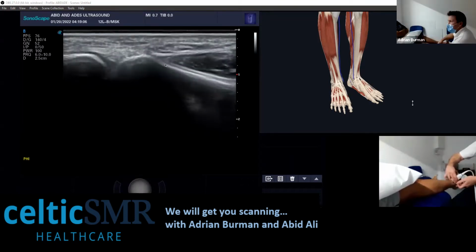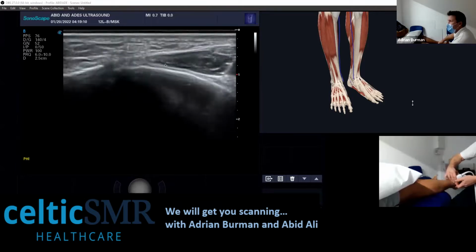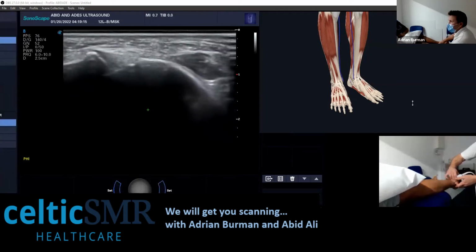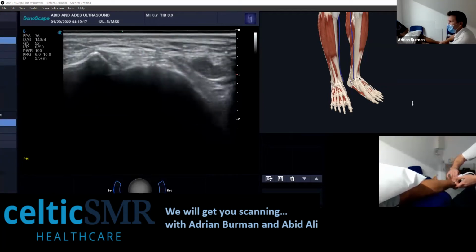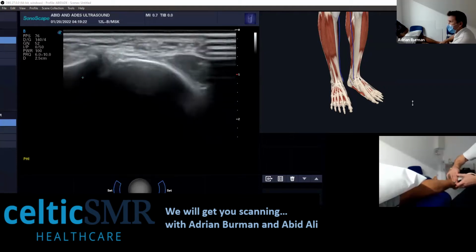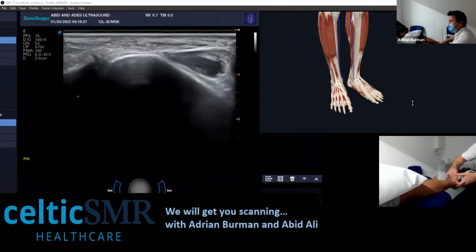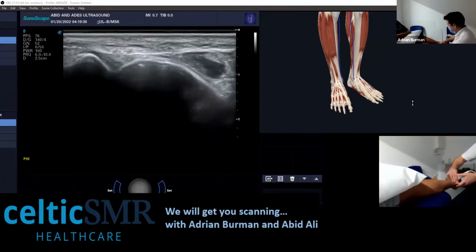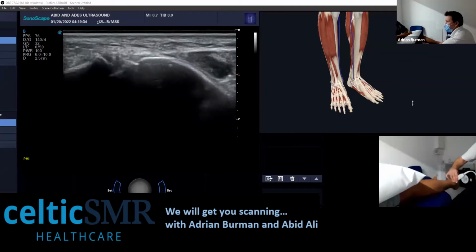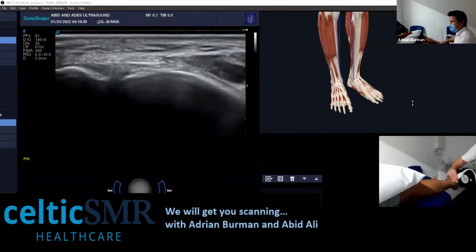Yeah, it's there. And then obviously just slightly higher than the syndesmosis there. You can put kind of Doppler on there. If you angle your probe, you can get it nice and sharp. I'll probably overgain this a little bit there. That's it. ATFL, AITFL. Yeah.